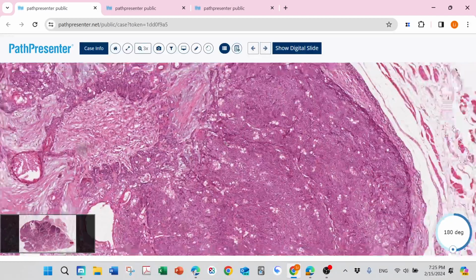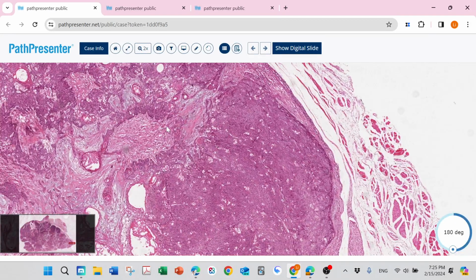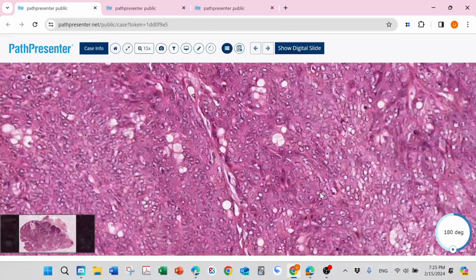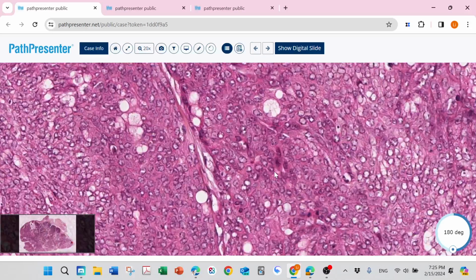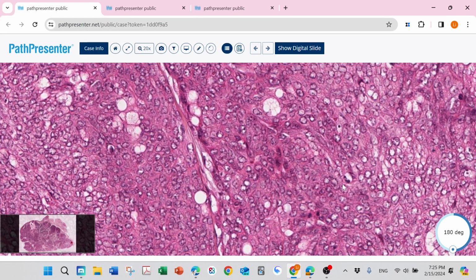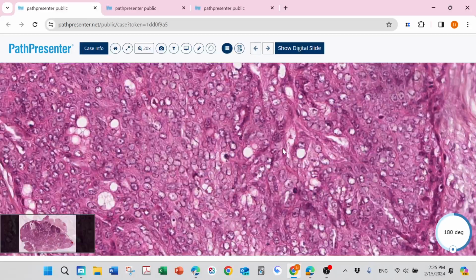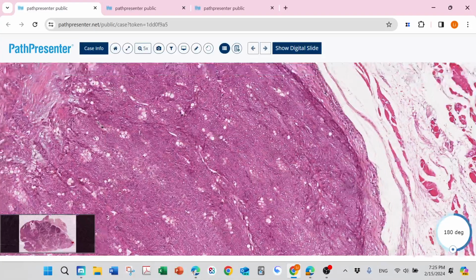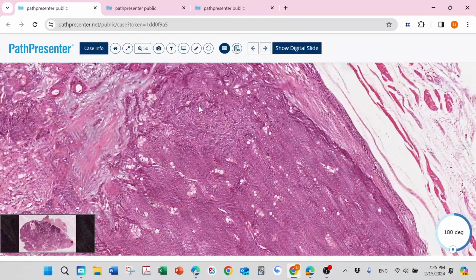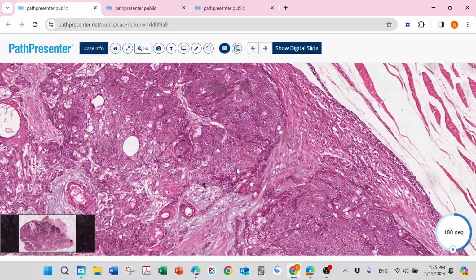But when we see these cells with this stroma, kind of infiltrative growth, then let's see the cytology of these cells. Some cells are really big, really hyperchromatic. Atypia like this makes you think it should not be a benign entity, in combination with the infiltrative growth.